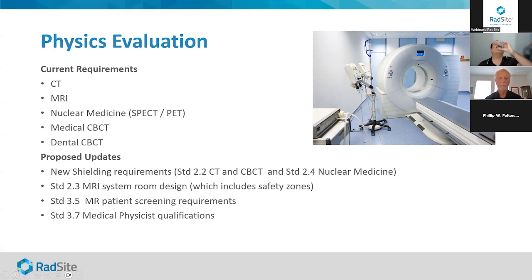Just because service has said it's been fixed doesn't necessarily mean that it's actually performing. MR, we actually require 3 data sets. We require a sagittal image data set, the site T1 and the site T2. We also accept 2 additional data sets that we define actually in our standards.